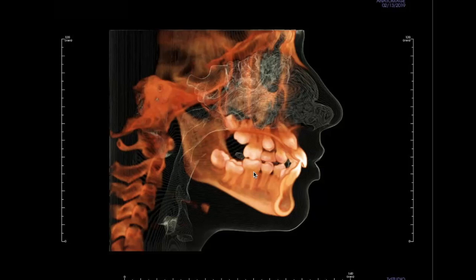And we also talked about the ability to expand. Now, if we expand, we're going to be uprighting the lower, so we're going to have some kind of movement going on back there, making more room, increasing the arch length. So there's a few things to our benefit as far as having those second molars come in. Anything else jump out at you on the Ceph?